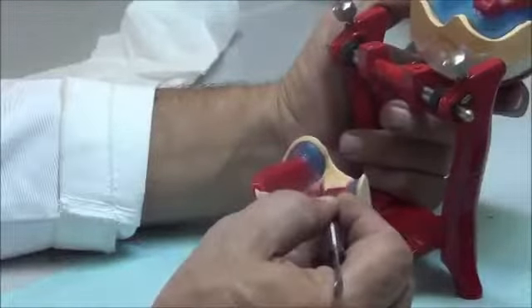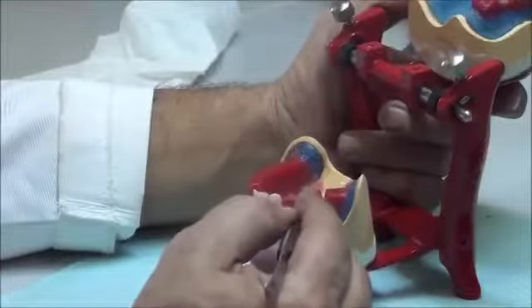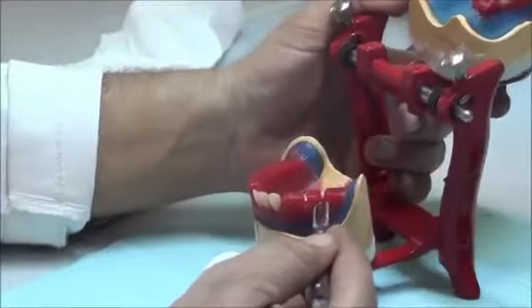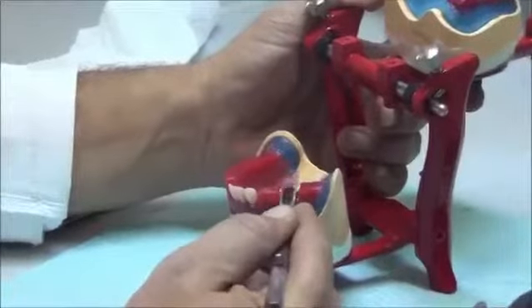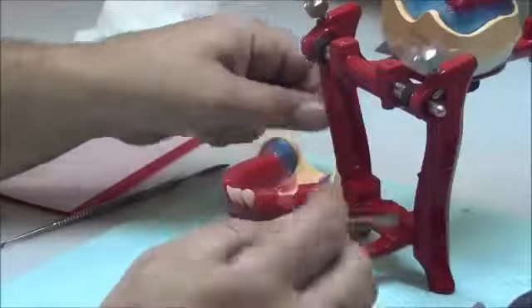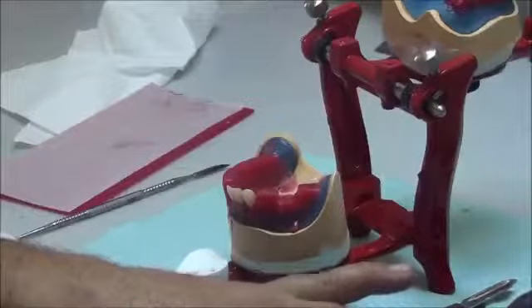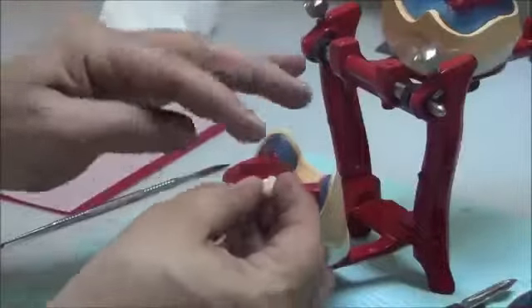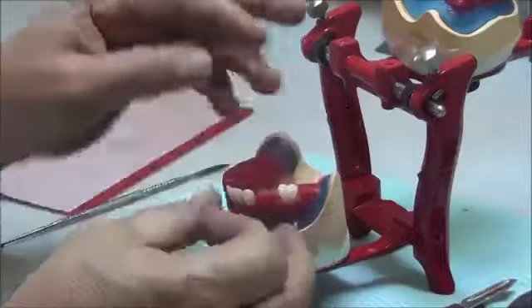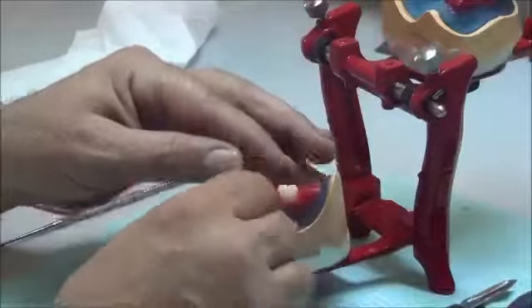After marking where its location should be, we open a box for the tooth and then we set it into the location. The first step is putting the tooth in correct relation with the upper in terms of cusp interdigitation. Once more, please observe your morphology. So the tooth is put into place. We check with the upper that the location is correct in terms of cusp interdigitation.